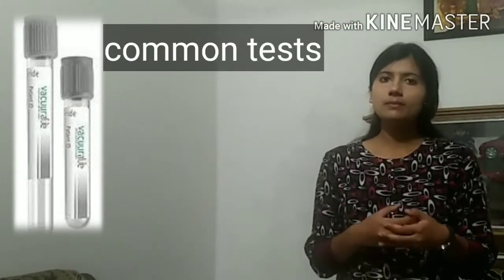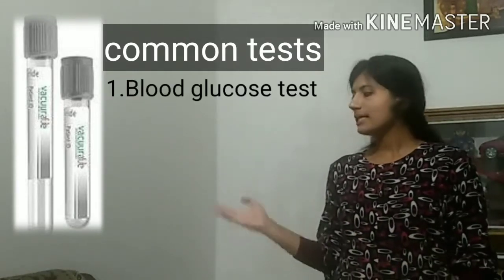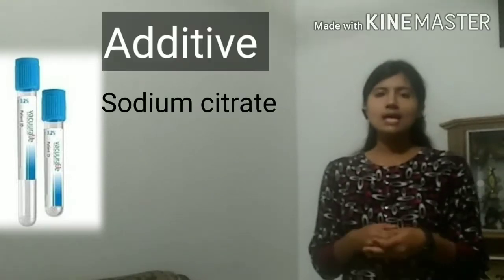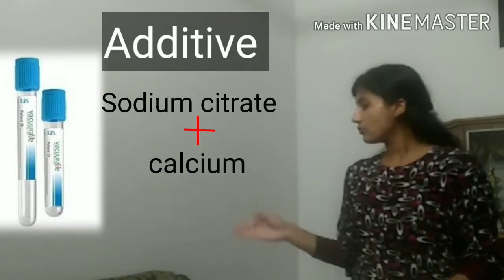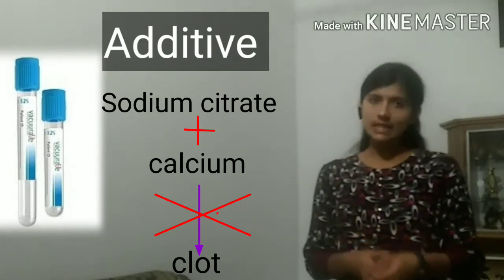Now, what are the common tests done by using gray vial? First, blood glucose test. Second, bicarbonate test. Third, blood alcohol test. Next, blue vial. The blue vial contains sodium citrate as an additive. Sodium citrate is an anticoagulant. It acts as a chelating agent and binds to calcium ions in the blood and subsequently disrupts the clotting cascade.